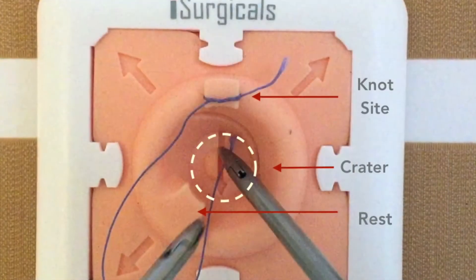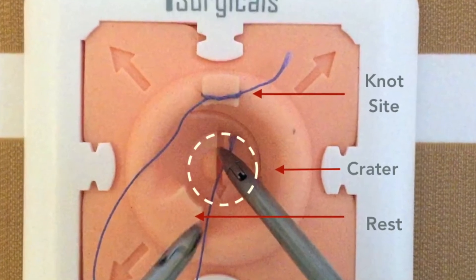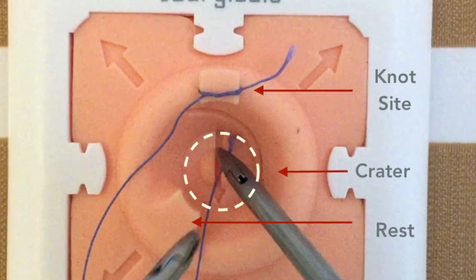The Knot Mentor has several features including the knot sight, central crater, and instrument rest, as well as six arrows which have been designed to guide instrument movements.